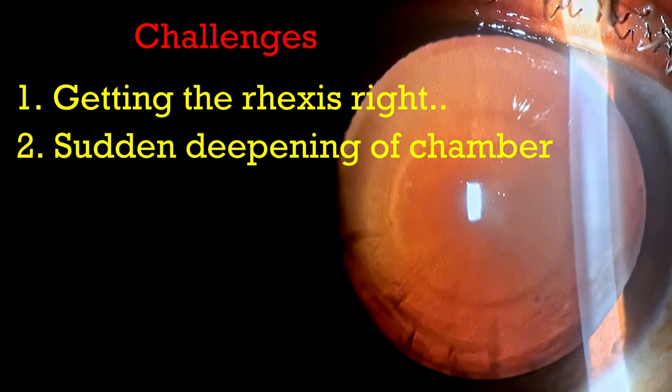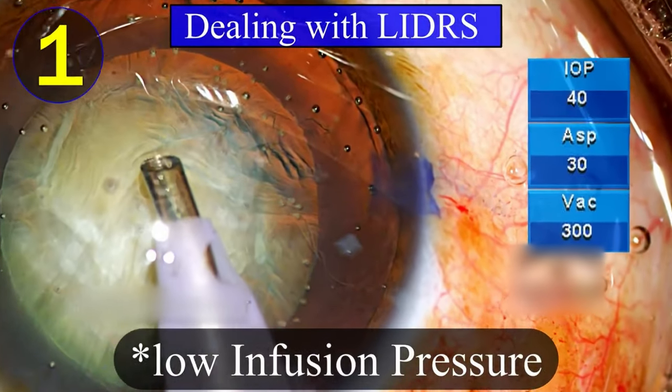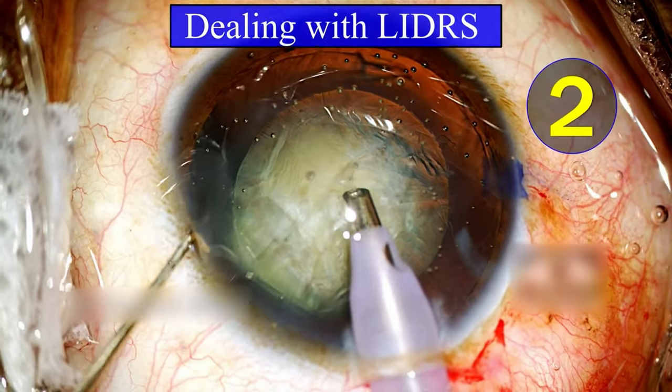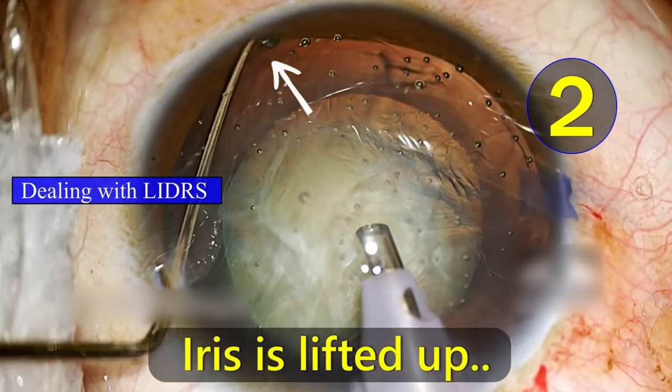The first priority is to get the rhexis right. Second, I would be concerned about the sudden deepening of the chamber, which can happen because of iris retropulsion syndrome. I don't want to work in an extremely deep chamber situation. I'll be trying to operate with a slightly lower infusion pressure by reducing the bottle height, and if required I'll be lifting up the iris when the infusion starts to prevent reverse pupillary block and iris retropulsion syndrome.